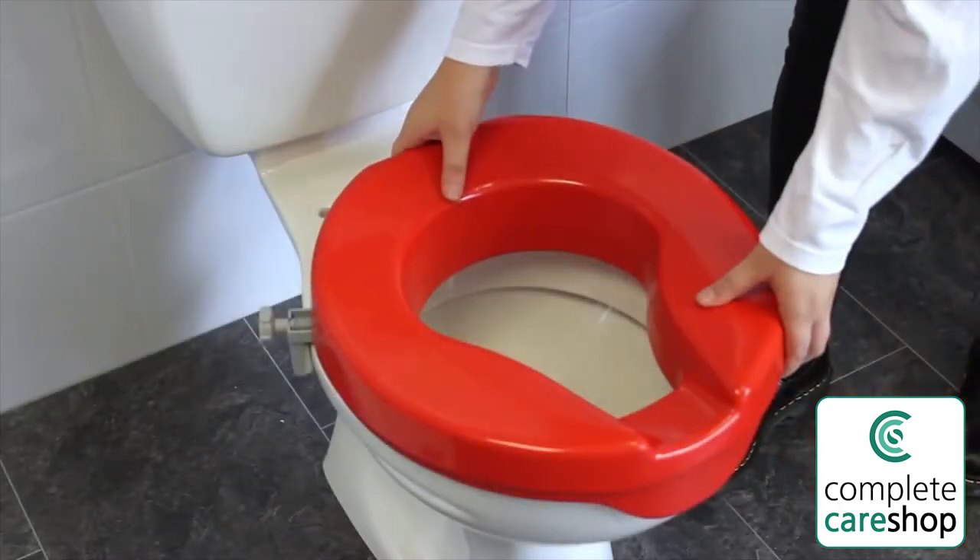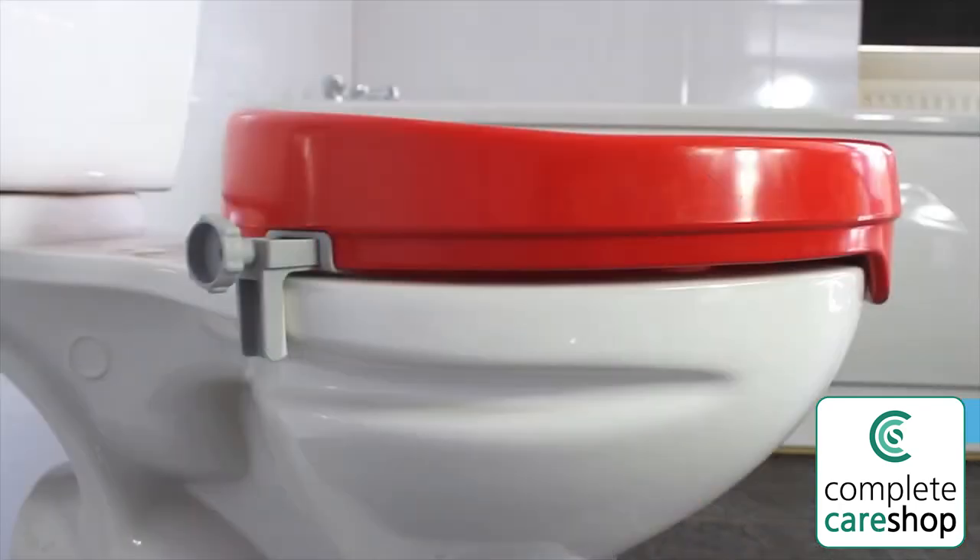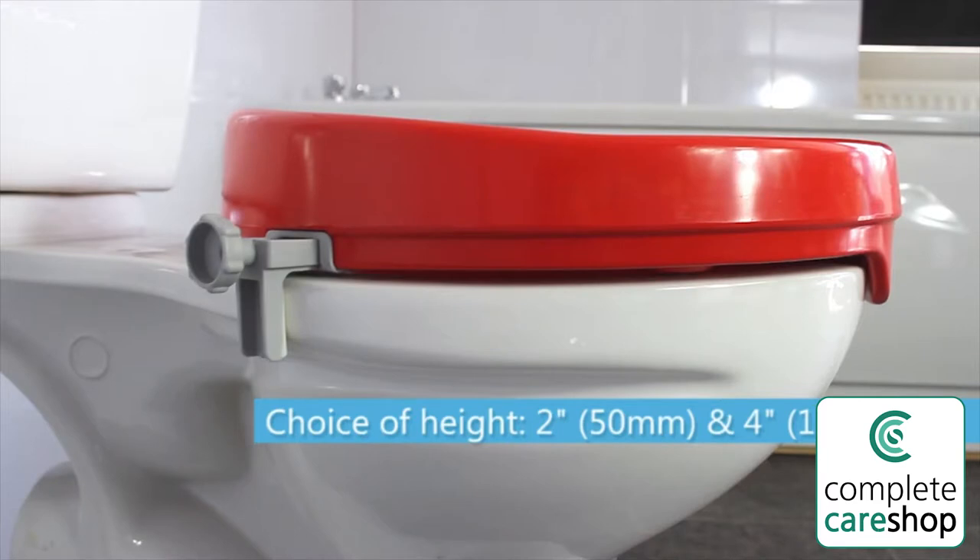There are two height options available to suit you. Choose from a 2 inch (50 millimeter) raise or a 4 inch (100 millimeter) raise.